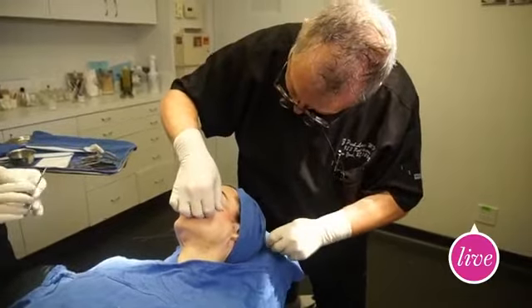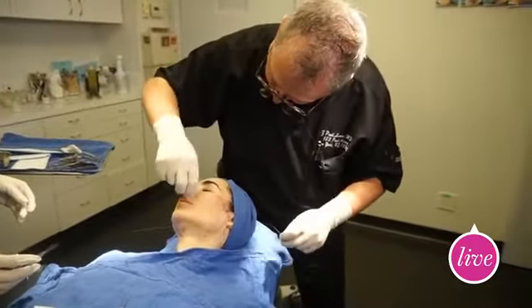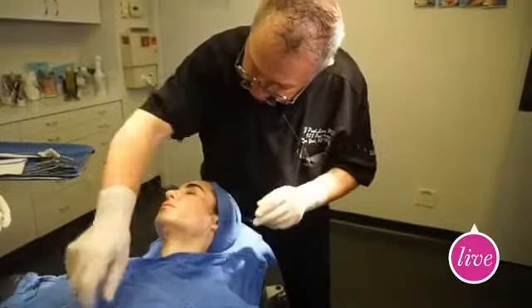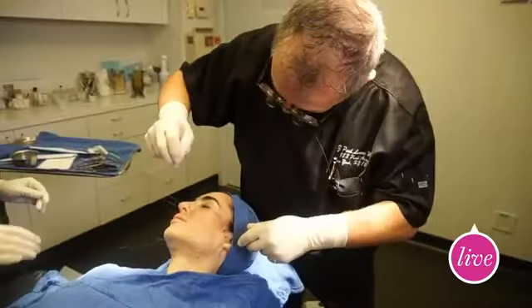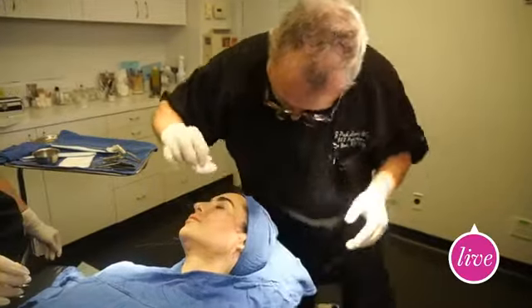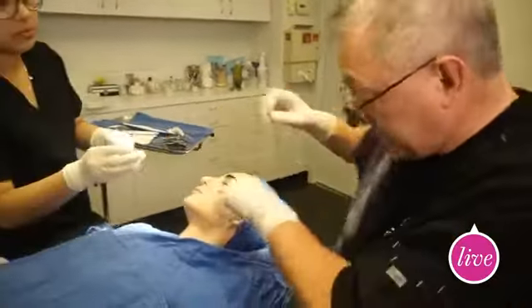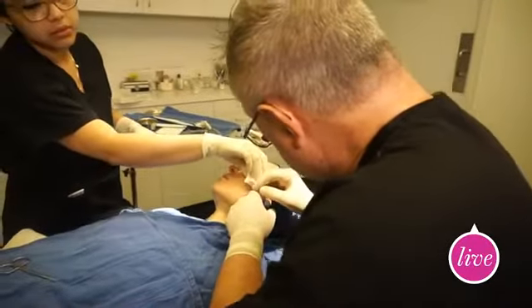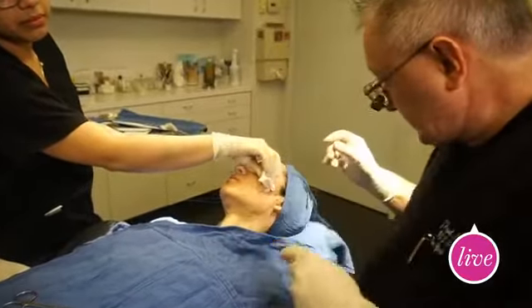And do you do that all on the same day? Usually not. I like to wait about 6 weeks before I administer what we call energy-based devices. And can you see the cones under the skin when it's finished? No, they completely disappear. When I'm finished, you can't see the cones right now. Me standing here, I can't see anything other than what's left outside the skin, but obviously you cut that out after.